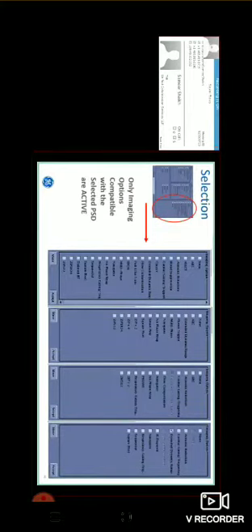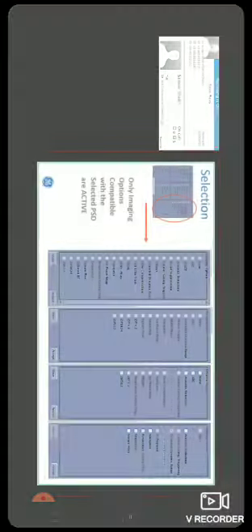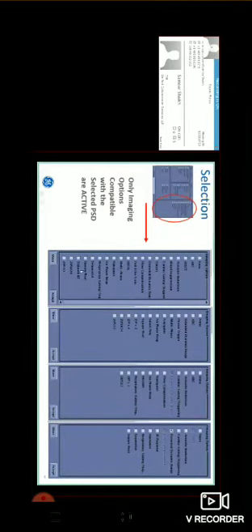If an option is not meant for that particular PSD, it won't be seen in the imaging options. So this is the complete list, but for some PSDs, parameters and protocols, we cannot see the whole list.